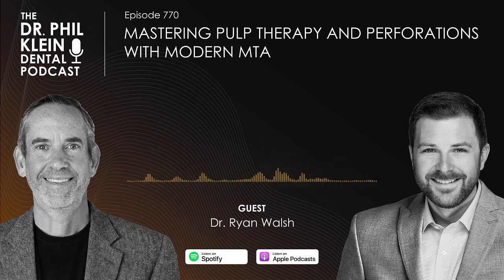Yeah, in a case like that, I'd absolutely recommend using an MTA-like product because that's what they're meant for. I would caution them to make sure that you can see the perforation because you don't want to inadvertently let some of this material fall down to the apex, because again, it's medical grade Portland cement. So if it falls down there, it's going to harden up over time. And again, some of these quicker setting materials with 3-minute set times, you don't have a lot of wiggle room. But if you can clearly define that perforation, repairing it with an MTA-like material is an ideal situation.